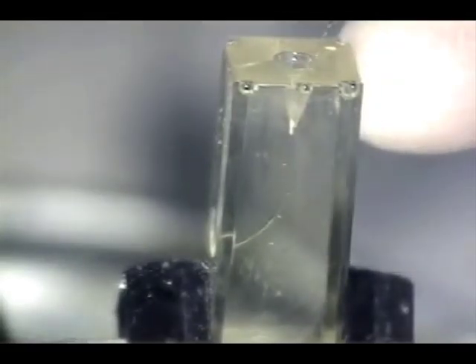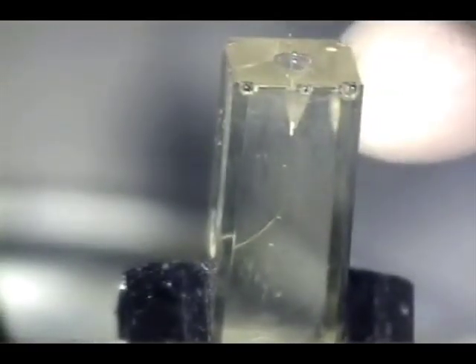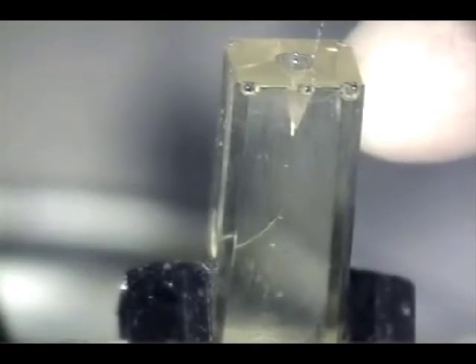We now instrument a duplicate curved canal in a plastic block, only we go one millimeter short, or to what would be the constriction.